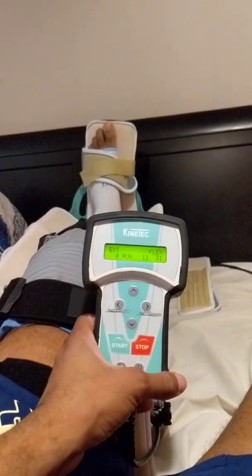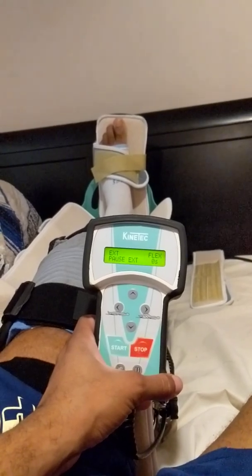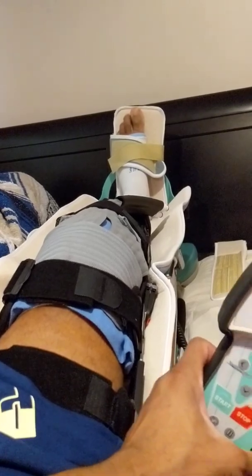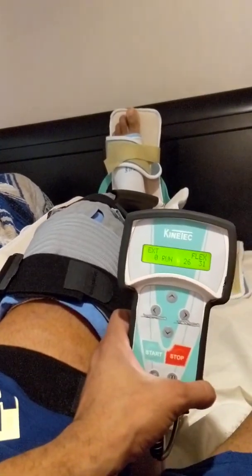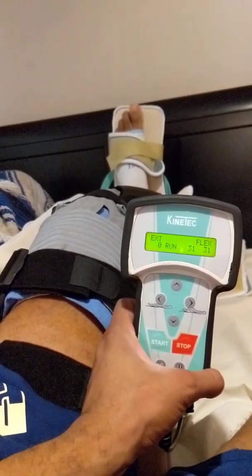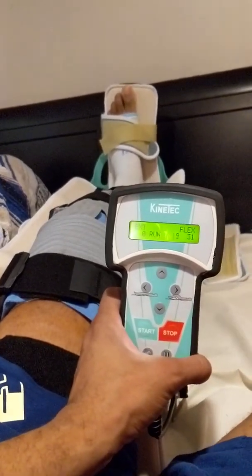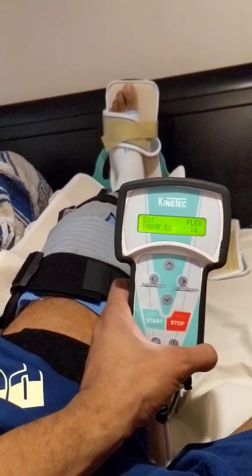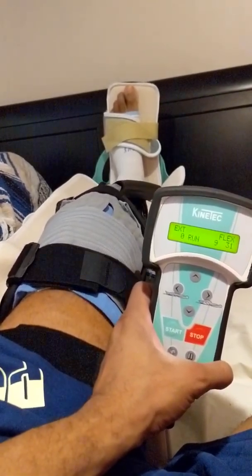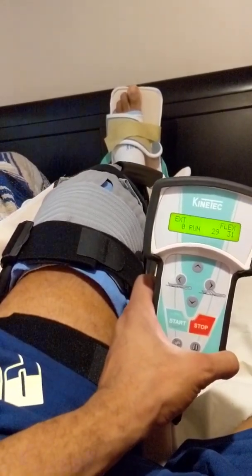Yo, check it out guys. They just dropped this machine off. You see what it's doing? It's working on my range of motion. If you see in the middle of your screen or towards the right of your screen, it says flex — that stands for flexion. There's a number under it, that's 31. That's the degrees. The first day they want me to go 0 to 30, so basically it's taking my knee from 0 degrees range of motion up to 31 degrees.